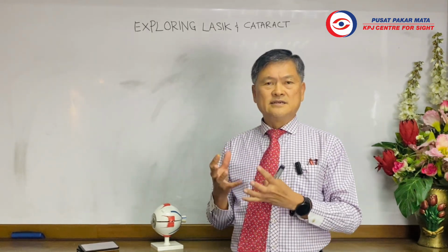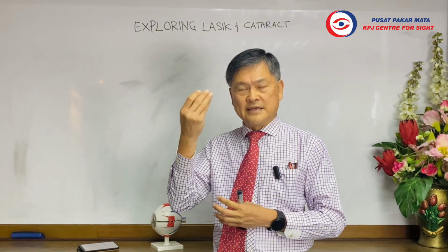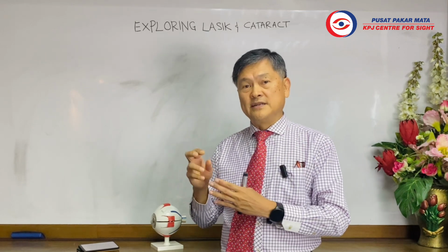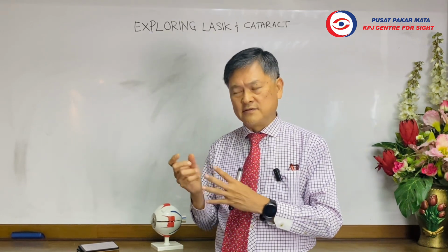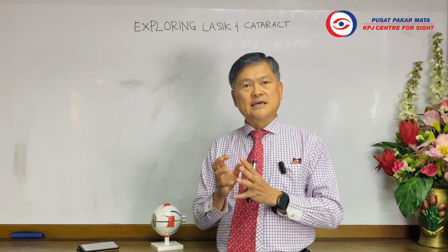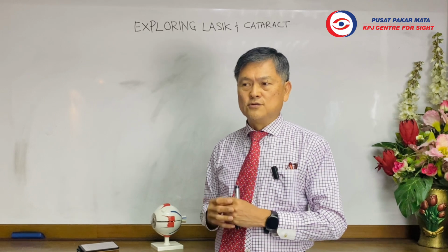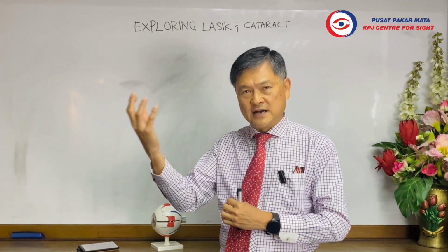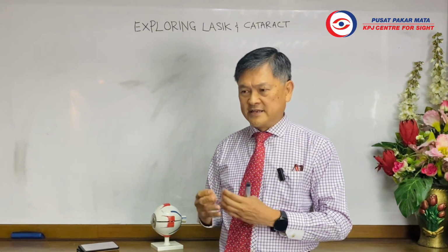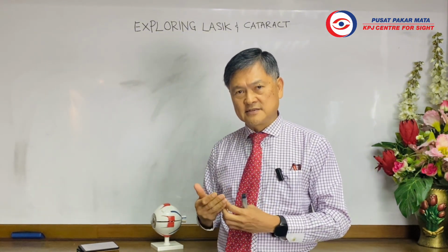Okay, as I said, cataract surgery involves removing the natural lens that is already cloudy inside the eye and replacing it with an artificial lens or artificial implant. Currently in the market, there are many types of lenses with different functionality. Some can allow the patient to see far or near well, and if they can see far well, then they need glasses for reading.